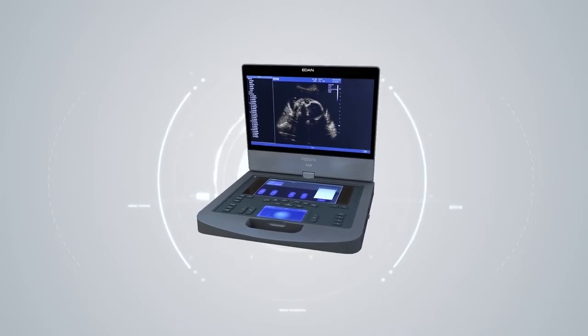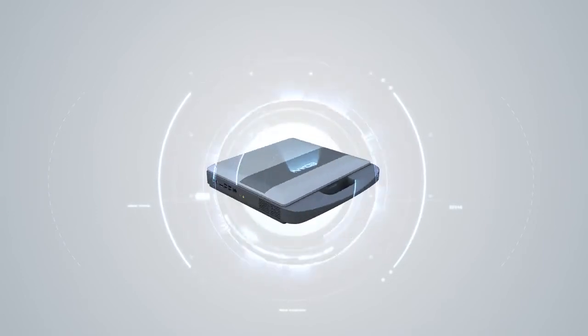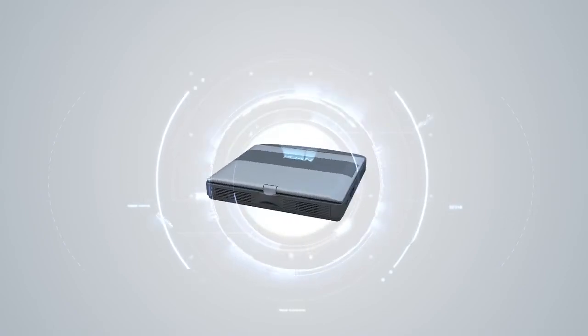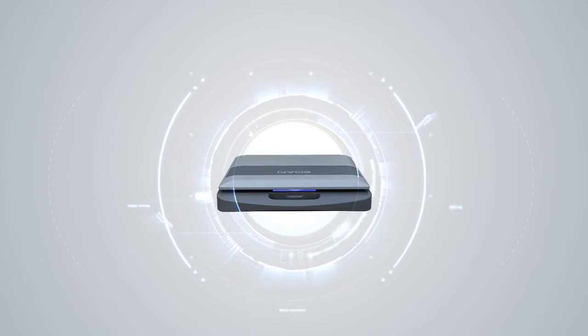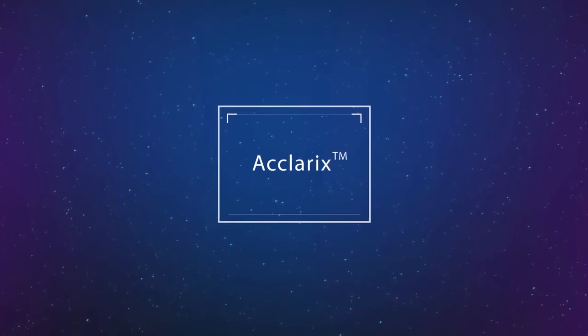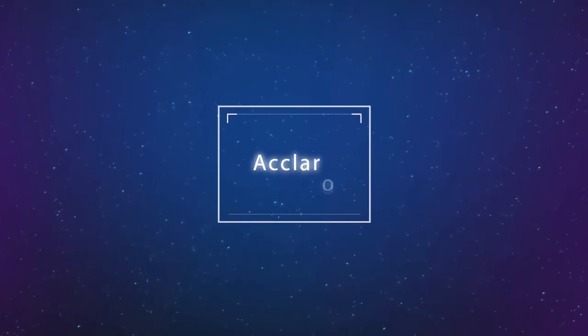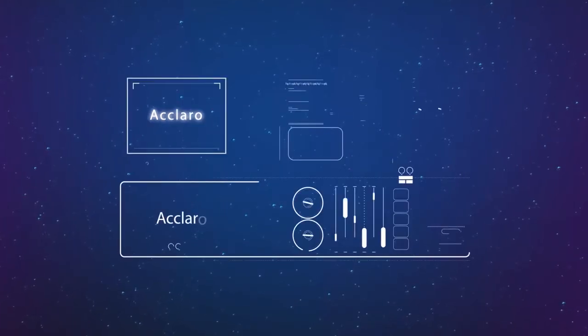Welcome to the Acclarix AX8, Edan's Premium Performance Compact Portable Ultrasound System. The Acclarix AX8 is the result of Edan's commitment to and investment in ultrasound. Acclarix comes from the Italian word 'Acclaro,' meaning to make clear.